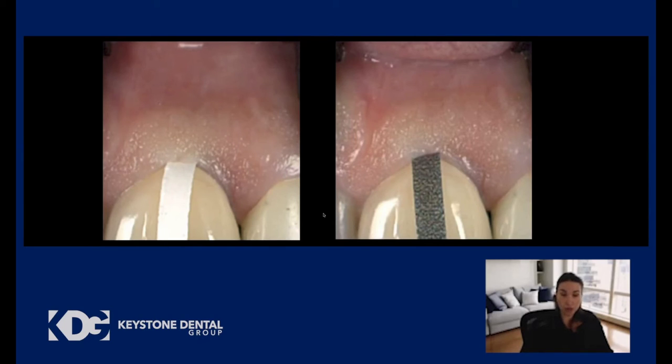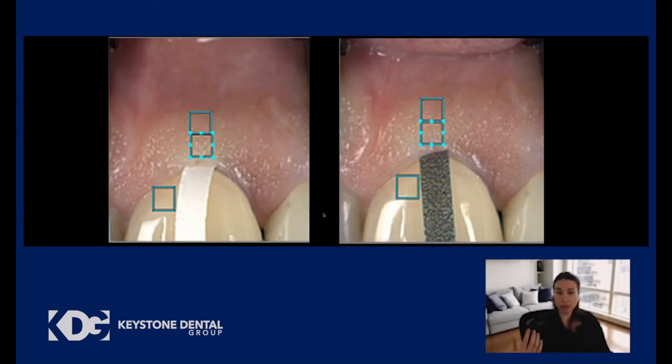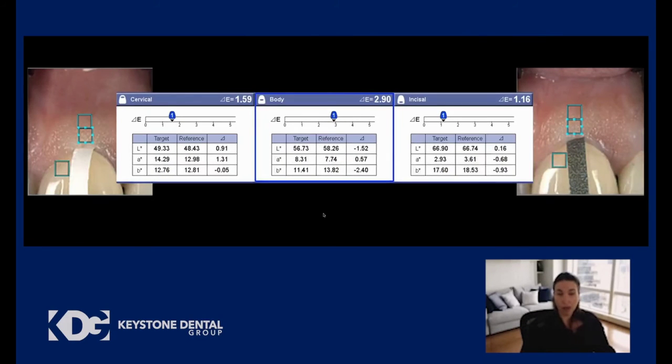This was a thick tissue biotype. I'll show you why it was a thick tissue biotype. The first thing that we did is we put strips of paper inside the sulcus, either white or black. And we measured the soft tissue color with the white paper in place and with the black paper in place to evaluate if there was really a difference in color between the two of them. And we see here the square that is highlighted, here in the right and here in the left, is actually the body measurement, which shows us a delta E of 2.9. It's high, but you will see how that delta E is with thin patients and how we determine how a patient was a thin tissue biotype based on that.